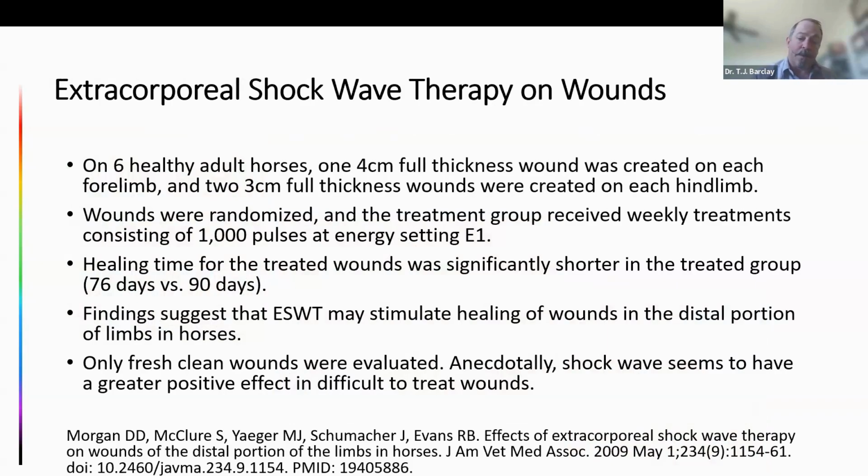On experimentally induced wounds in the distal limb of horses, there was a control group and a group that received weekly shockwave treatments. And the healing time in the shockwave treated group was significantly shorter.